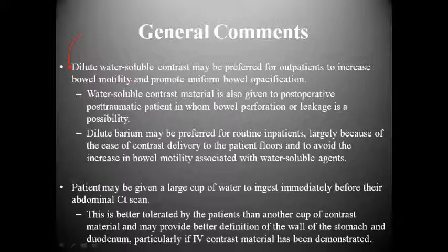And here's my basis for that. Water soluble does not give you the same risk that dilute barium contrast medium will. Dilute water soluble for just about every patient can take it. There's very few patients that have significant iodine allergies that are not able to utilize gastrografin or whatever your water soluble contrast may be.